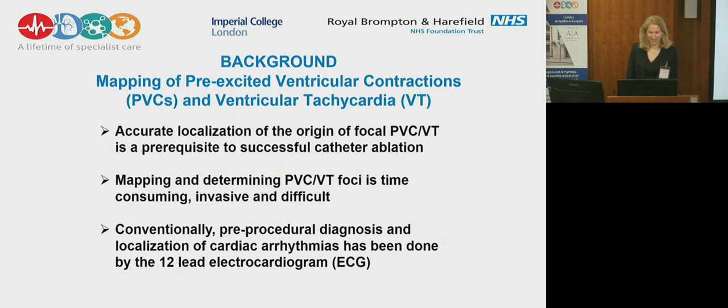And that would ideally shorten our time in the lab later on if we can say, okay, we can do something, we can localize it. And we could possibly plan the whole procedure very well by making sure that we have the right approach. We know if it's an endo or an epicardial location, and the whole setup, the team that takes care of this patient, will probably be better prepared.